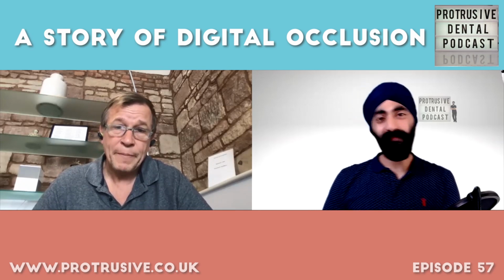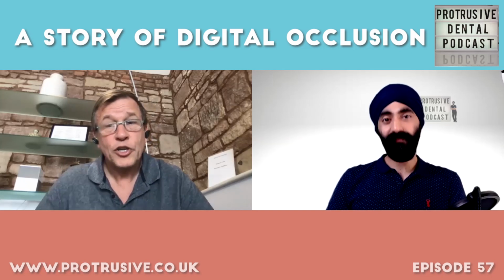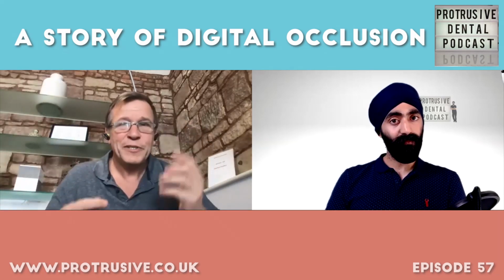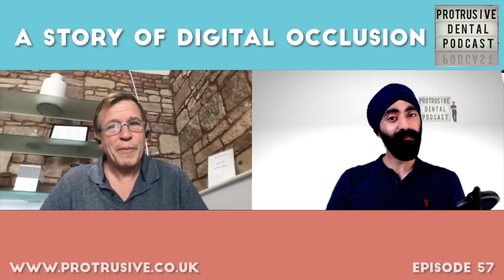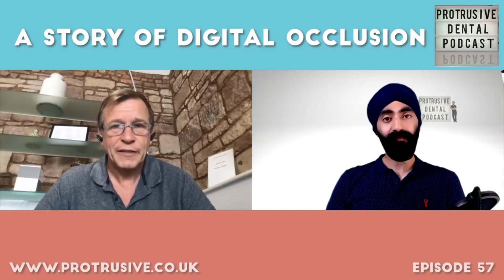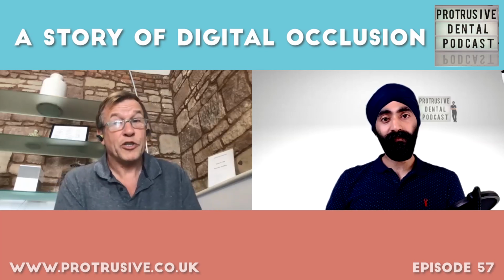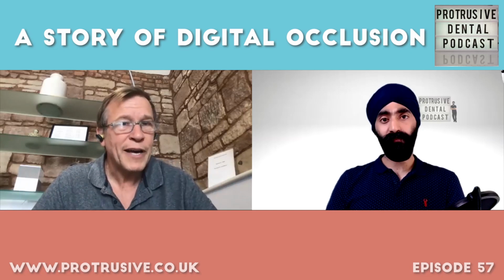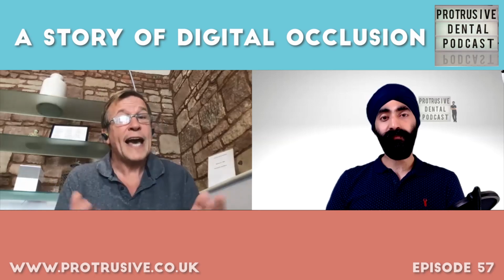The cool thing with digital now is that we can do smile mock-ups and things like this, and we can share our vision. Someone can walk in and, to be arrogant for a moment, I'm thinking, yeah, I can see what I could do for you. But you've always got to remember, they can't share that vision. We've got to find ways of sharing the vision with them. Digital, whether it's photographs, whether it's a 2D smile where we can show them befores and afters, and we can do a 2D smile now in 10 minutes with the great software that we have, or whether it's an additive mock-up.